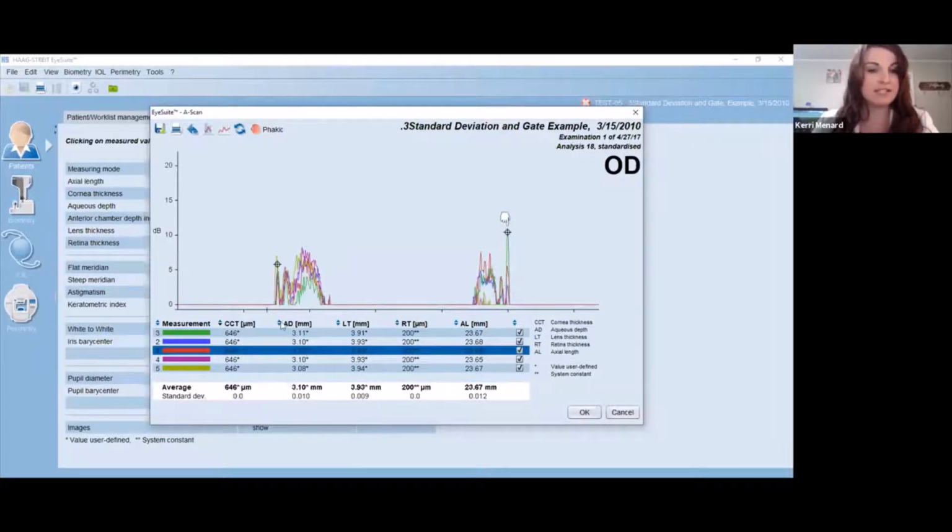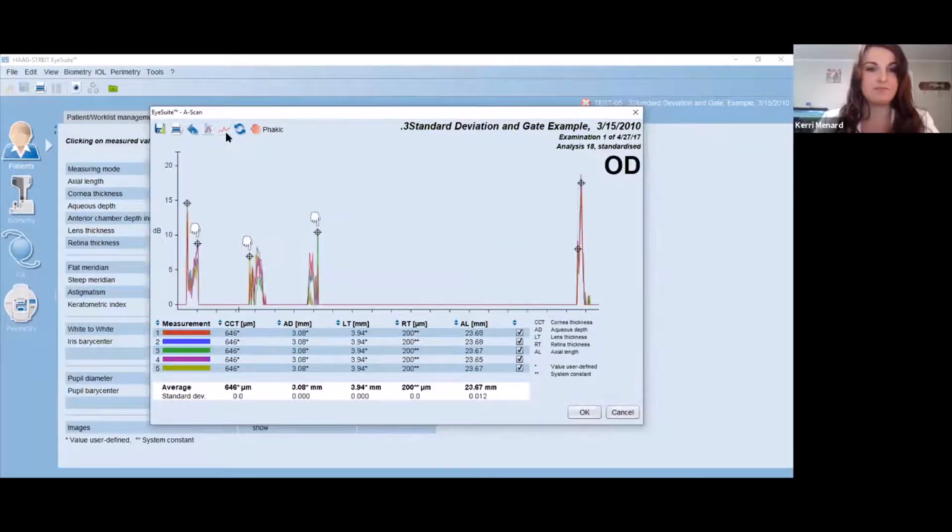Now I do not have an aqueous depth caution, but if I had, I can do the same by clicking and bringing it up and dropping it on the last spike of multiple colors. We do recommend that you use this fifth icon, which is Fit Scan to Window, to zoom out at the end and then just review your placement of these gates to verify.